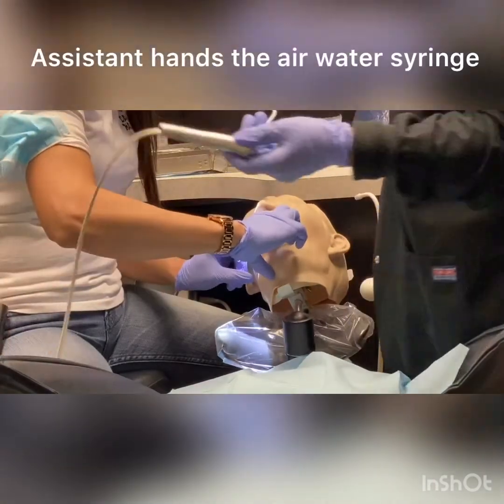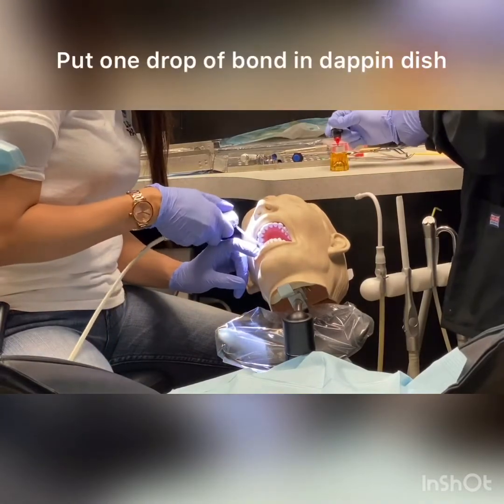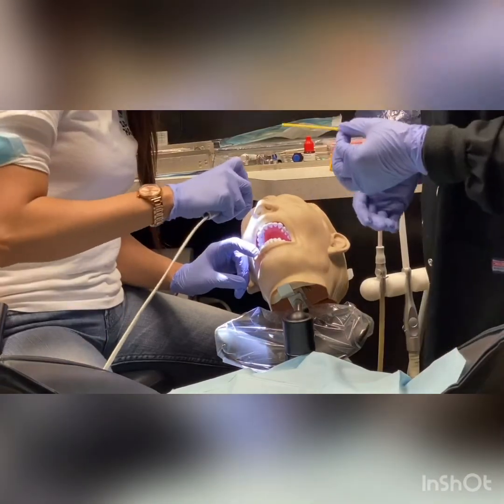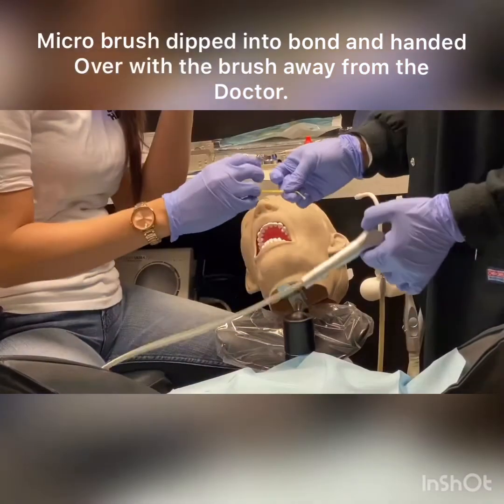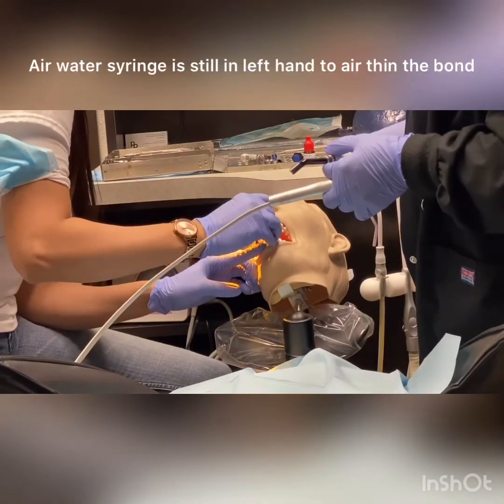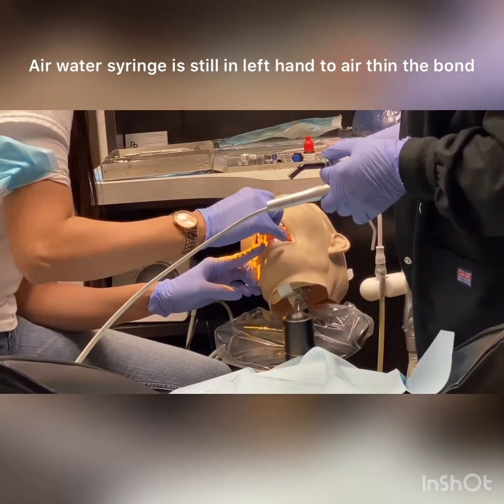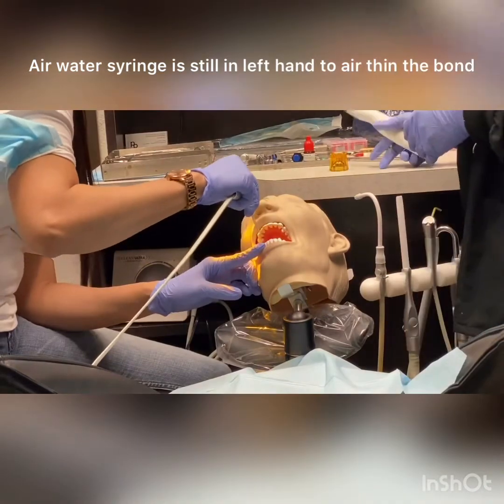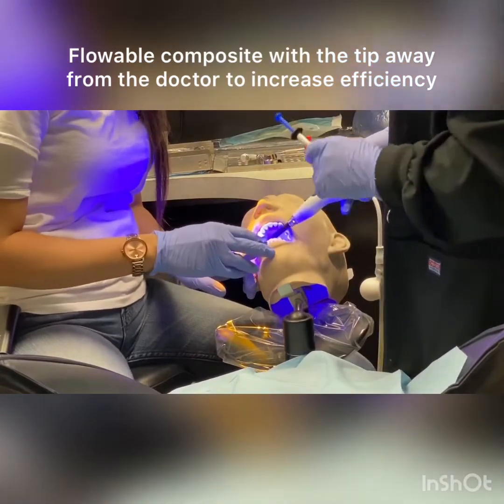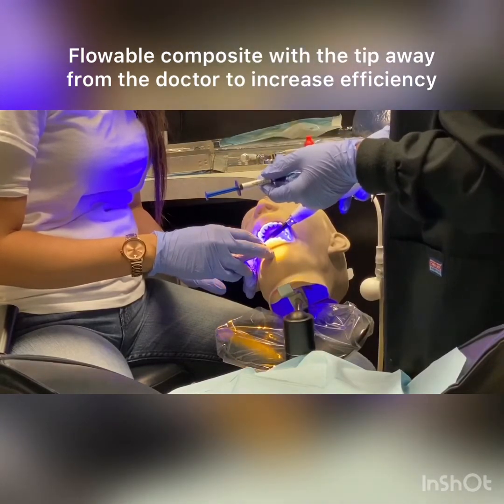She's going to dry the tooth really good. And while she's drying, you'll be preparing your bond to go into the tooth. She's going to bond the tooth, and then with the bond, you cure it for 10 seconds. I like to paint this in for 20 seconds, so it'll be a minute until I actually give it back. Then I take the air-water syringe, I'm going to air-thin it, and then that's when we're going to cure it for 10 seconds. In the midst of her blowing the air, I'm already ready for the next step after the curing, which is the flowable that she's going to add into the filling.